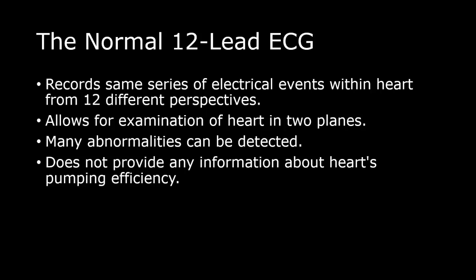You can detect many abnormalities within the 12 lead. It does not provide any information about the heart's pumping efficiency, but you can use deductive reasoning, critical thinking, and the skills that you've learned through learning what is normal and now learning what is abnormal to determine, hey, at least we can identify that these may be the areas that have issues mechanically with the heart as well.